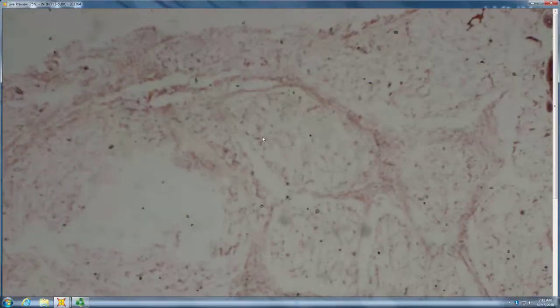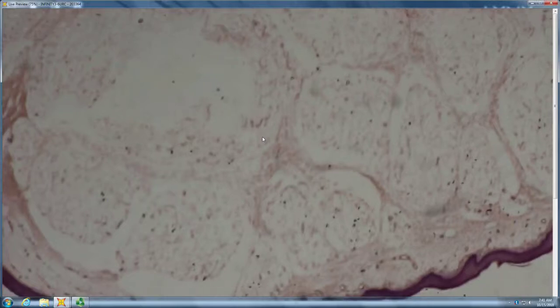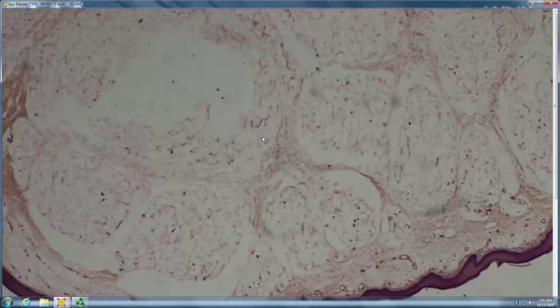Okay, how about that? Another specimen. There's a lot of fat in there. Pretty high up. So first, you want to know what the clinical was, right? Yes, please. Is this something like a nevus lipomatosis? But this is a little girl with missing fingers and teeth and one small eye and red stria all over her body at birth, and now they're getting yellow. Pretty bad. That sounds like Goltz, right?